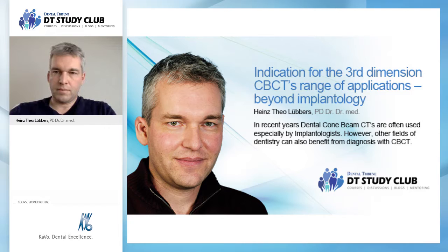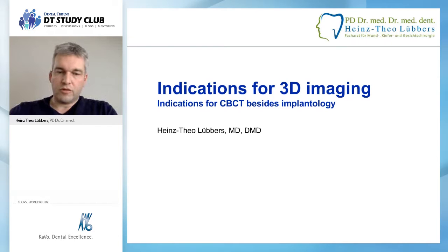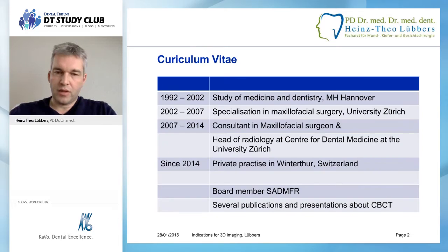Dear colleagues, it's a pleasure to have you here, and it's an honor for me to be able to give this webinar. We are talking about, or I will talk about, indications for 3D imaging. And I don't want to focus on implantology exactly, but on all the indications we might find besides implantology.